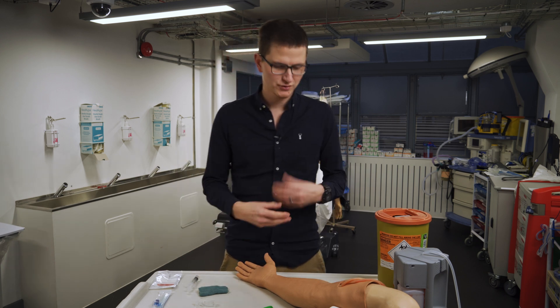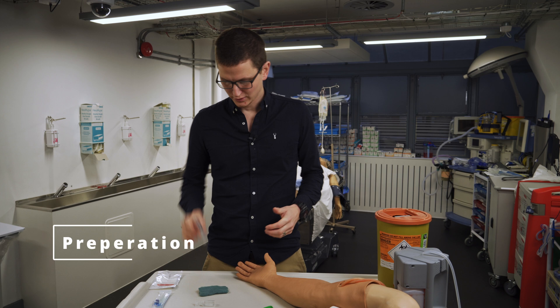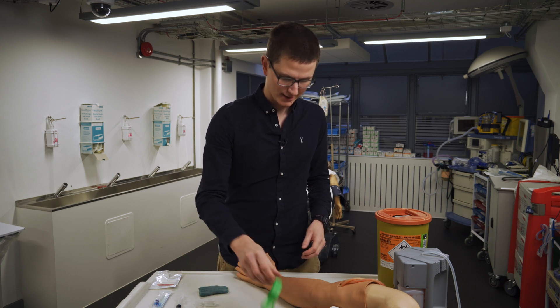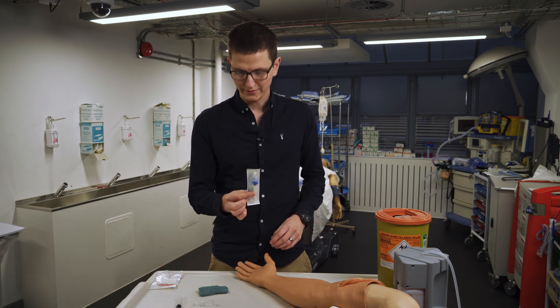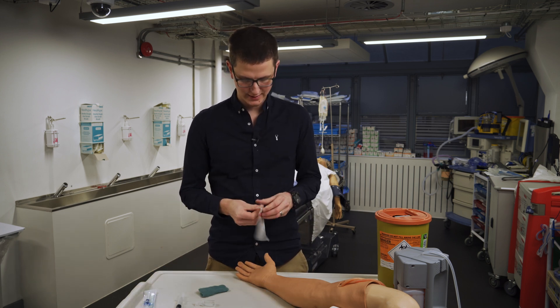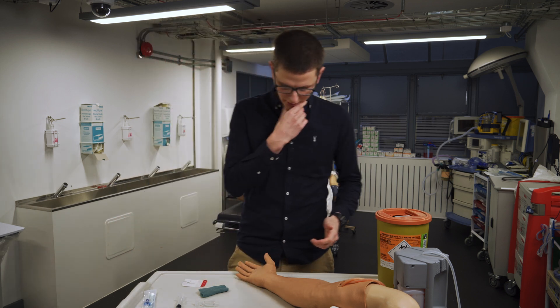For this demonstration I won't be wearing gloves just because it's easy to see what I'm doing. First step, we make sure that we have everything ready. I have my flush which I have already pulled up. I've got stuff to clean the site. I have a tourniquet, and we have our IV cannula or gelco, our fluids, something to clean up some blood, and something to tie the IV line down. These come in all shapes and sizes — you can use tape, whatever you've got.